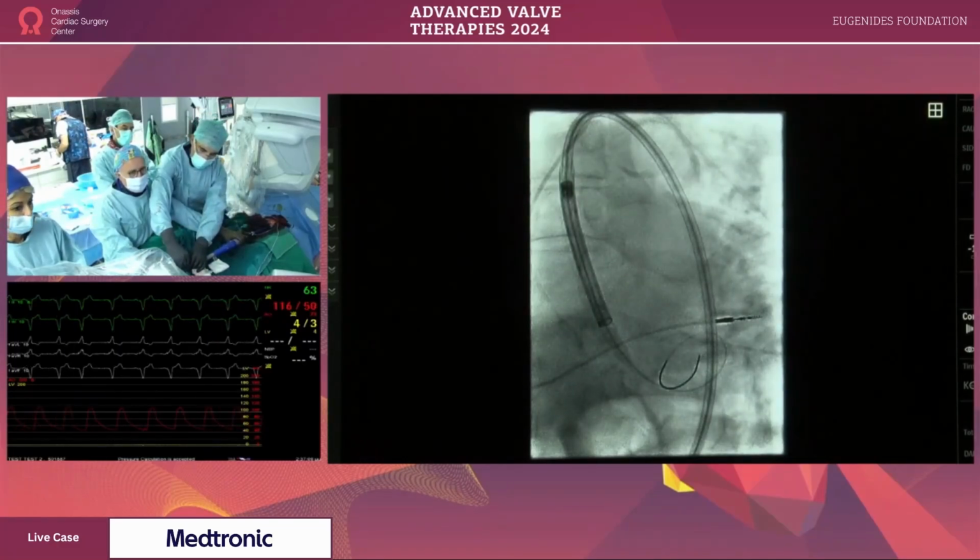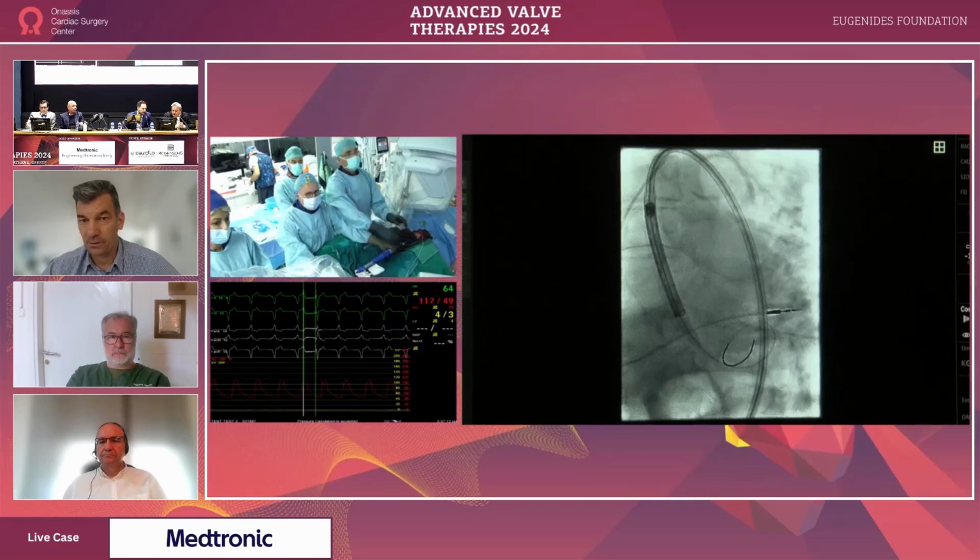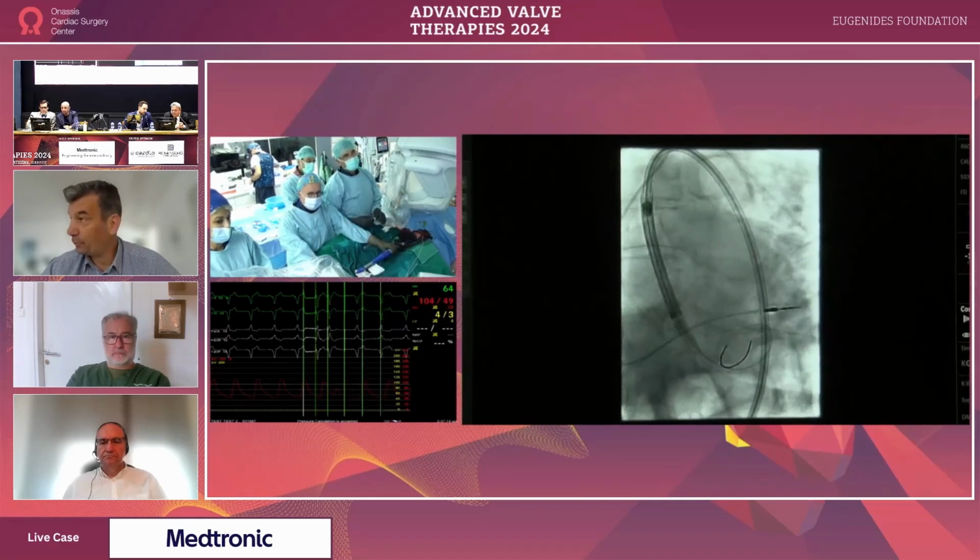Yannis, I think you are looking for the cusp overlap angle. Yes, we are trying to figure it out.